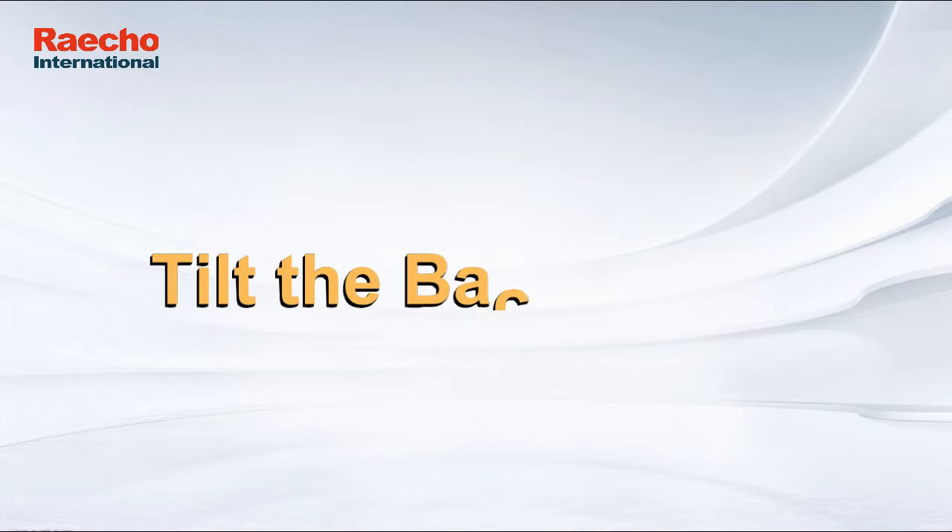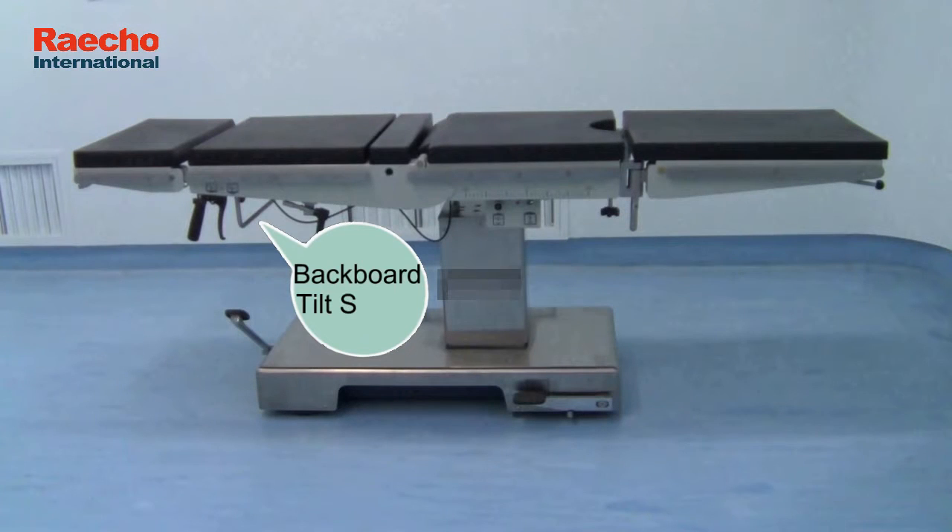Tilt the Backboard. Backboard Tilt Switch.